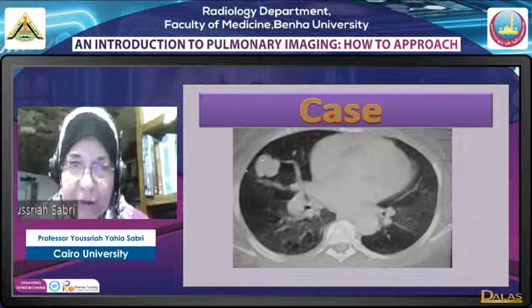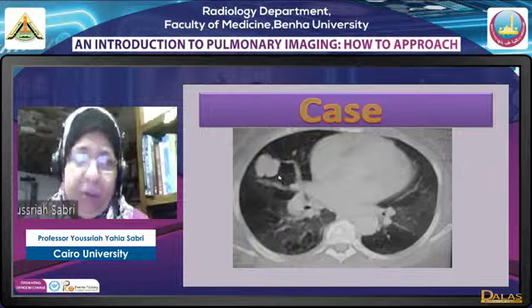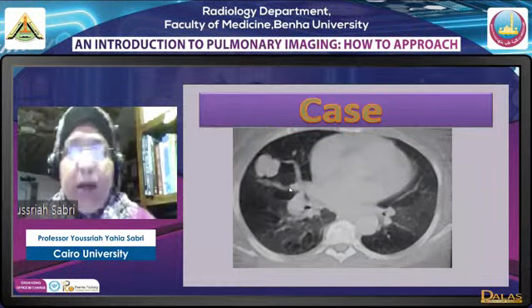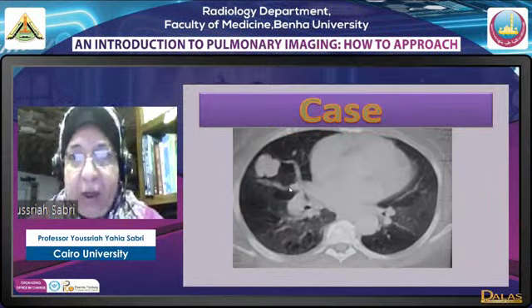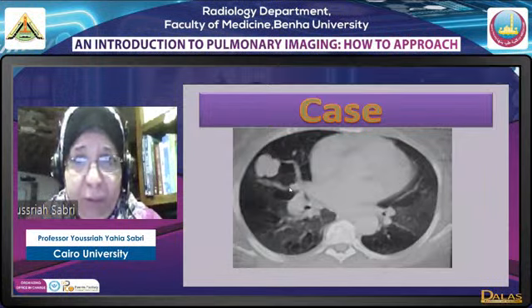So when we have a lesion, peripheral with lobulation or smooth outline, whether nodular mass, with prominent, markedly prominent vessels supplying it, this is an AVM. If we have an AVM, okay, I have diagnosed AVM possibly. Okay. So am I done at this point? No, I won't stop at this point. It must have a CT pulmonary done.